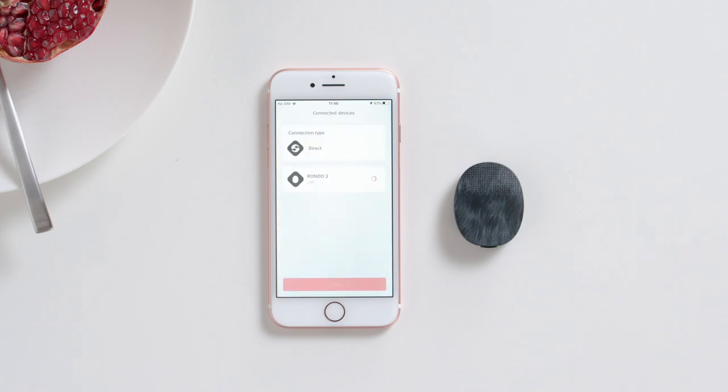You will now see the battery status for your connected Rondo 3 audio processors, as well as the approximate time remaining. Please note that you can only check your battery status on your phone if Rondo 3 is directly connected to Audio Key 2.